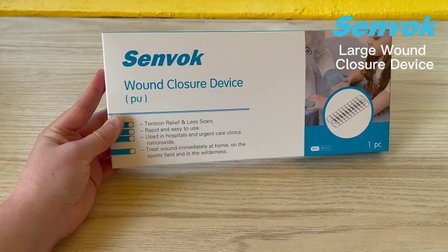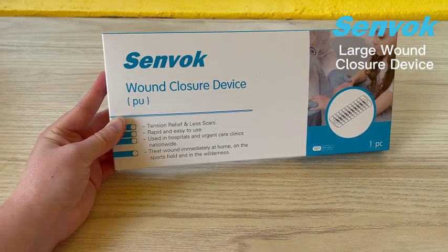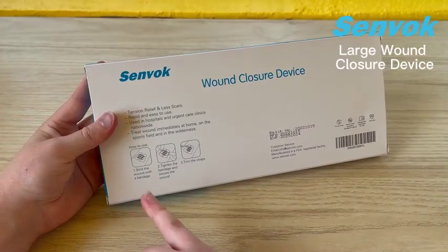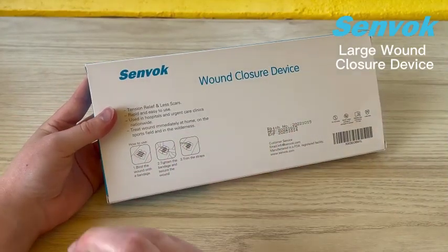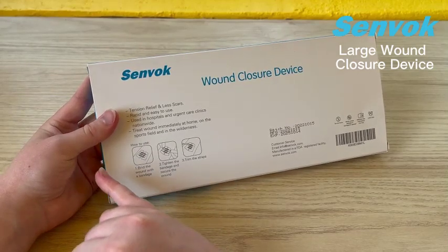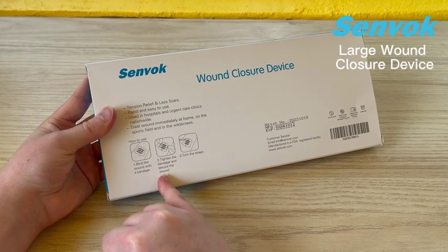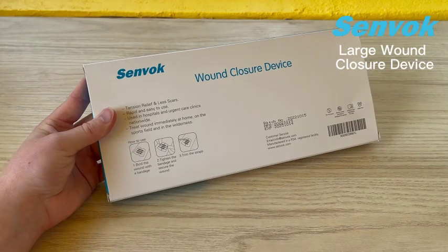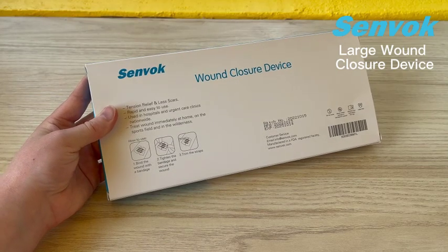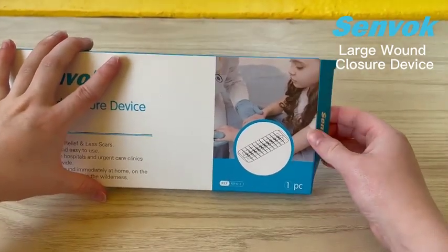So if you're just at home, on the sports field, out on a hike — no matter where you are, you're going to want these in your first aid kit. Let's take a look at the back. There are very simple, easy steps — just one, two, three on how to actually use them. You're going to attach the bandage to the wound, then use the strings on the bandage to tighten and close up that wound, and then trim off the extra string created by closing and tightening. It's a nice, quick, and easy process.